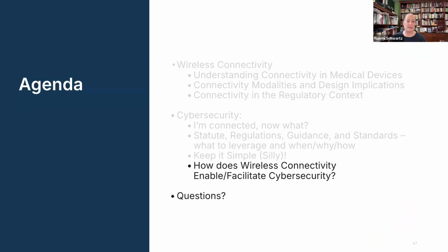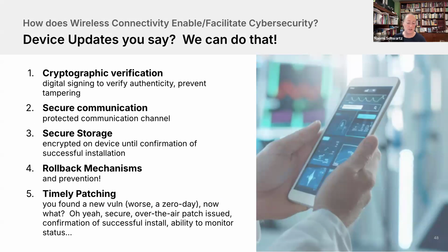How does this wireless connectivity enable or even facilitate cybersecurity? Because it's also a new attack surface, right? So you're like, well, I don't want to add it because now I have to protect it, but it actually facilitates certain things. If you have cryptographic verification, you have some digital signing that allows you to verify authenticity. Is that actually the support package coming from the provider I think it's coming from? You have secure communication. You can share data back with other providers, other people who are representing the patient, advocates, family members, caregivers.